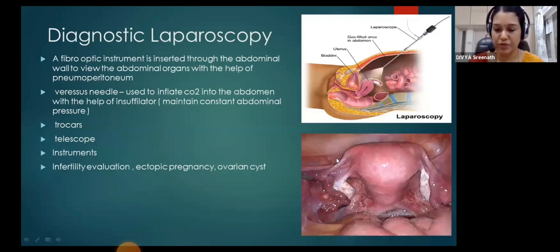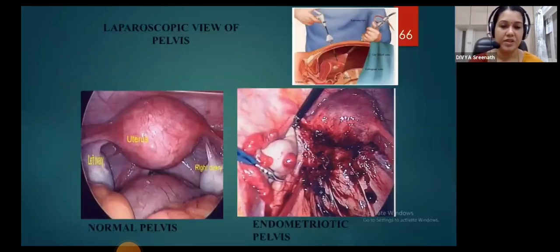This is a laparoscopic view. You can see a normal uterus with this white. This is an ovary, and this is a fallopian tube. This is the normal view of the peritoneum, and the pouch of Douglas, all are clear. All the membranes, just look for all the findings. This is mainly done as a part of infertility evaluation, or also as a part of a treatment modality.